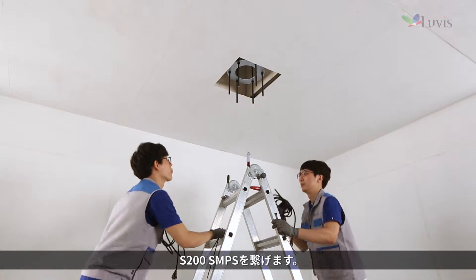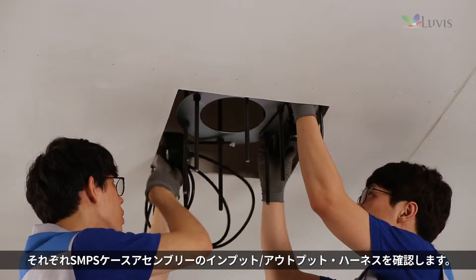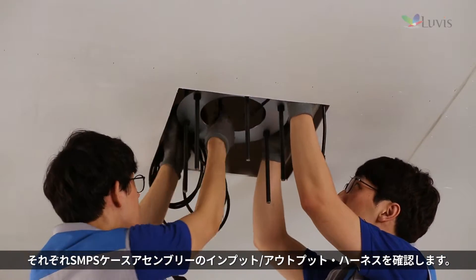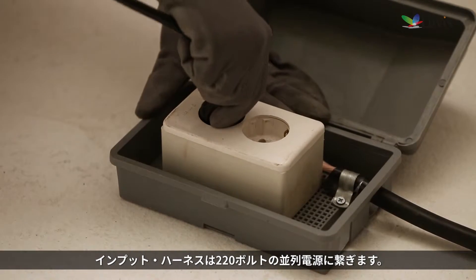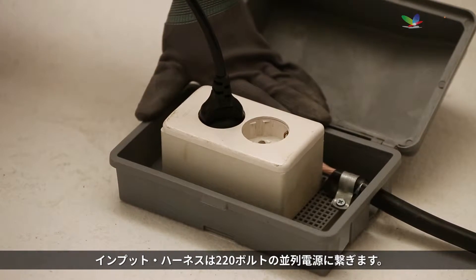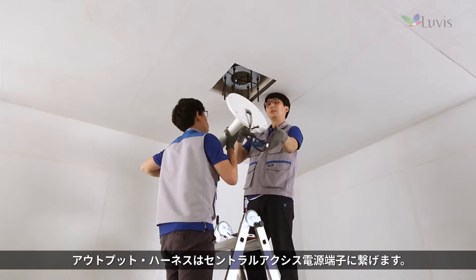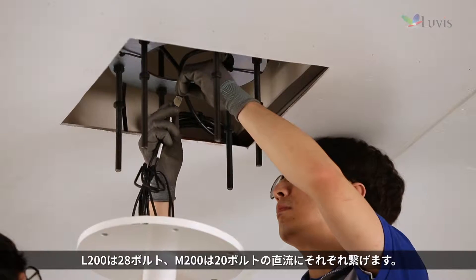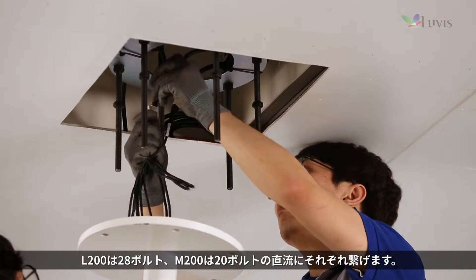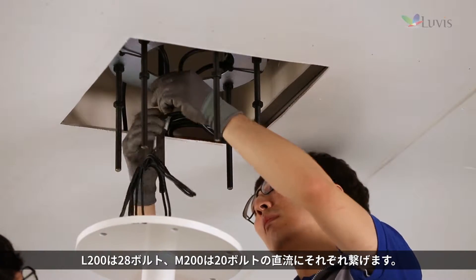Connect S200 SMPS. Check the input-output harness of each SMPS case assembly. Connect the input harness to a 220-volt parallel power source and connect the output harness to the central axis power supply. Connect L200 to 28-volt and M200 to 20-volt DC respectively.